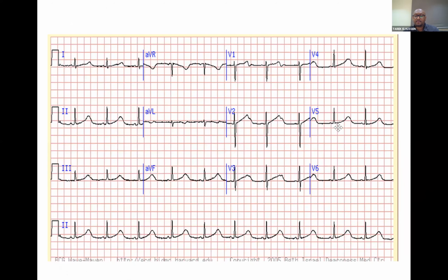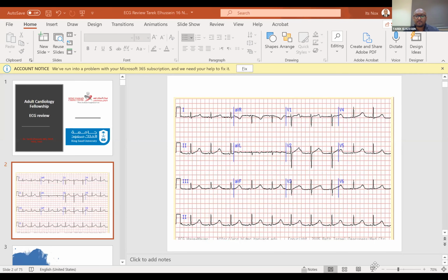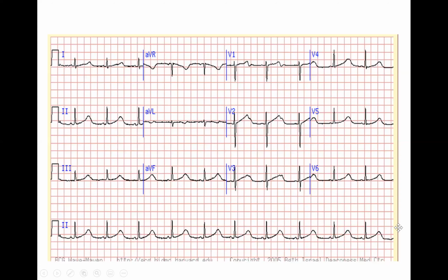Rabah Usman. Okay. This ECG is sinus rhythm. It's normal axis. I noticed an abnormality in V2. There looks like a P wave. Okay. You're suspecting that this is a P wave? P wave, after the P wave, it's a non-conducted beat. Okay. Anything else?